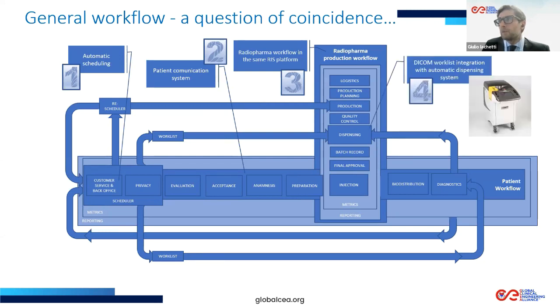Again, we spoke about safety. It's very important to have a dispensing system that is connected with the DICOM workflow, like a tomograph, and like the normal connection of a tomograph with the RIS, just to be sure about the anagraphic data of the patient, to be sure that the patient is the one who will do the diagnosis in the tomograph, and the same one for whom you have produced the dose.